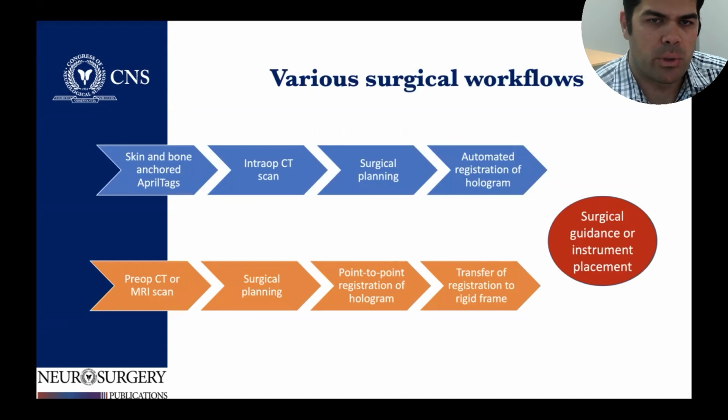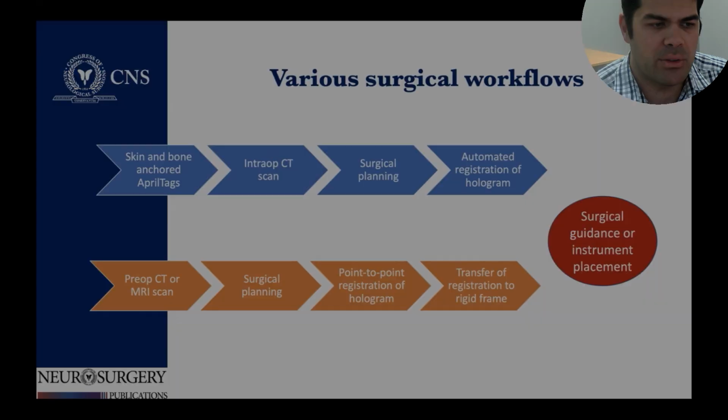There are various surgical workflows that you can use. Here's an example of skin and bone AprilTags, basically these fiducials that could be recognized by a CT scanner, then also seen by the VisAR camera and used to register a DICOM image to a hologram directly to a patient, or in our cases, a cadaver or phantom. You can basically place these tags and then obtain a CT scan, do your surgical planning, and then automatically register the hologram and begin surgical guidance.